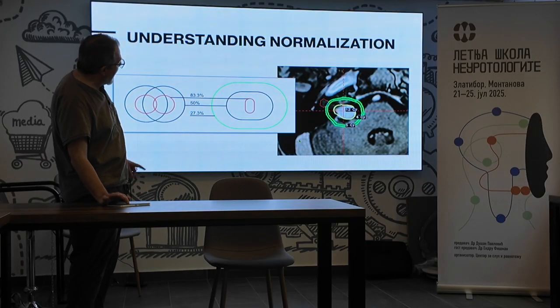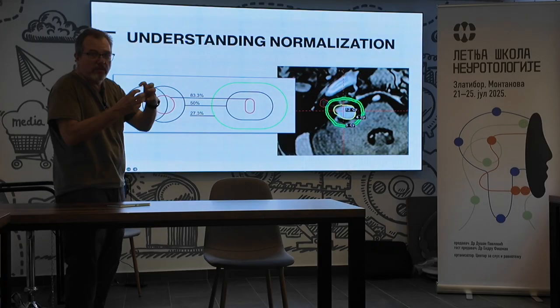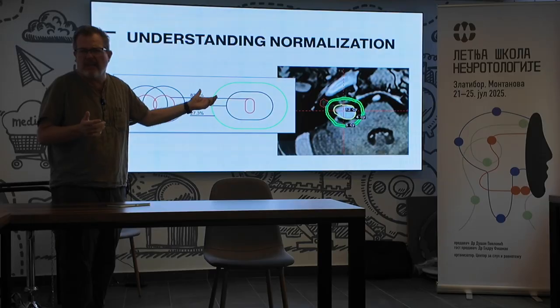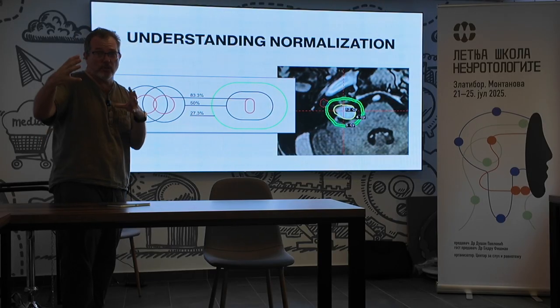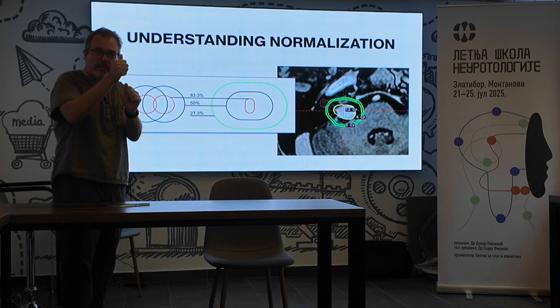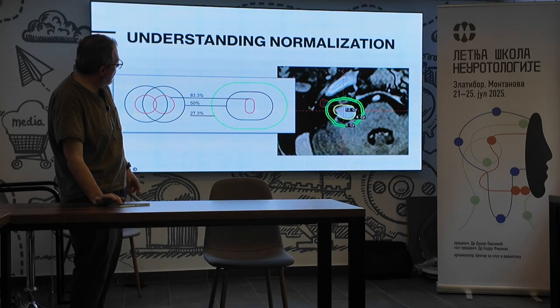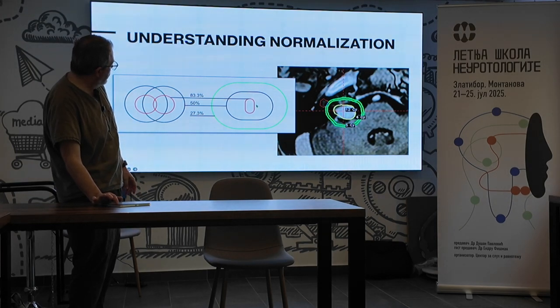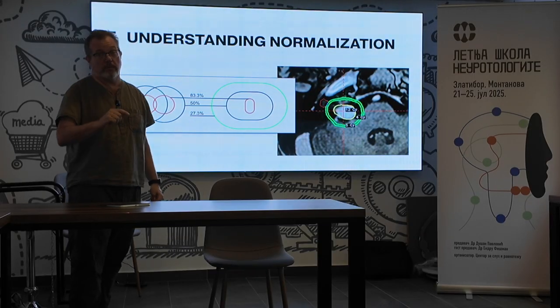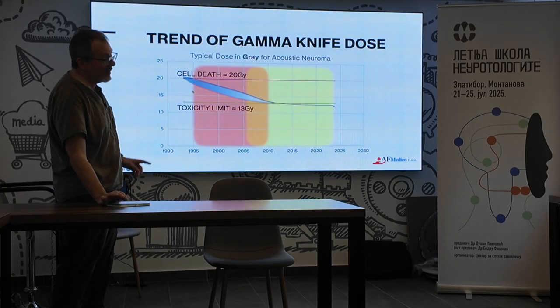And if you have more than one single sphere, that's a theoretical single sphere. If you add more, and you usually have anywhere from 5, 6, sometimes 12, sometimes very complicated, the actual high point of the dose goes smaller and smaller and smaller. So in a multiple, you end up with a tiny percent of the actual tumor getting a lethal dose. So you're giving just a few percent a dose that kills the tumor.